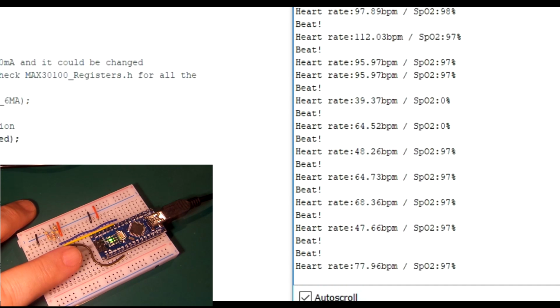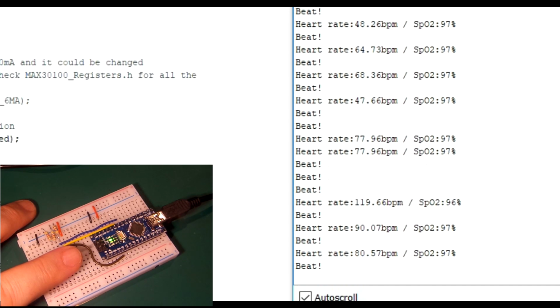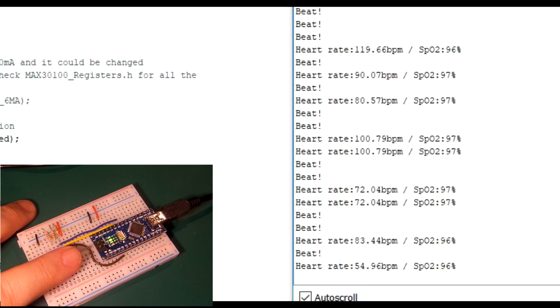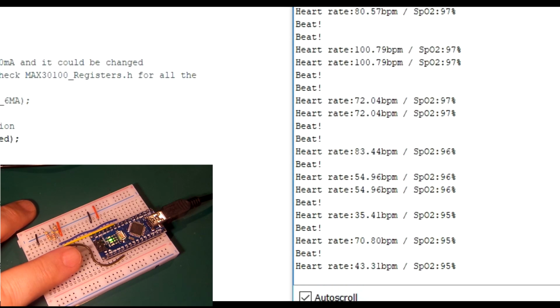And that's a word you don't hear very often, but it is well used for this situation, because the other sensor is incredibly sensitive to movement. This one is actually not as sensitive. Even rocking it backwards and forwards, which I am doing, not as bad. Perhaps a little bit there.